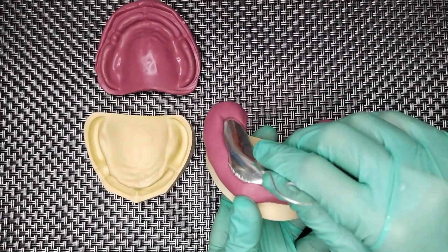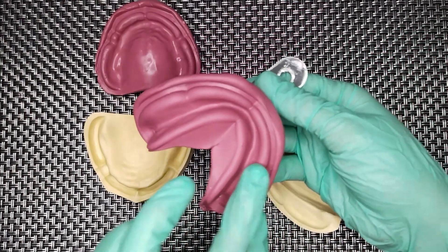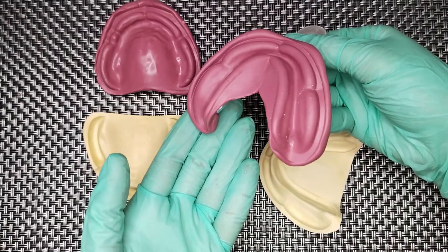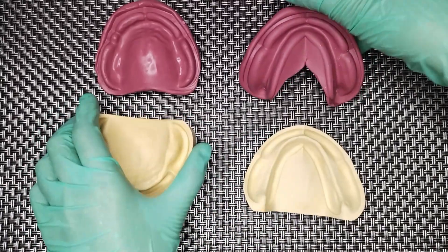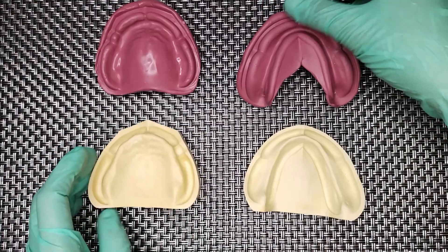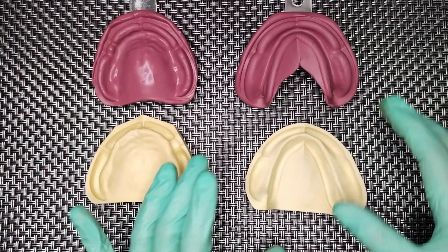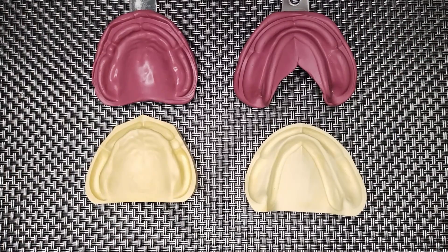For the mandibular impression, inspect it as well. Now this is ready to be poured with your plaster of Paris or your dental stone.